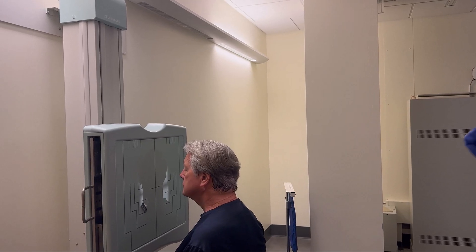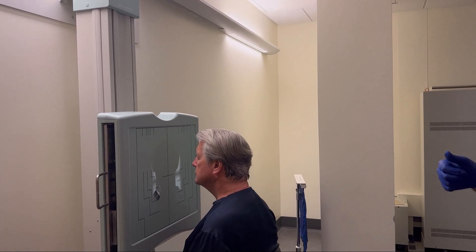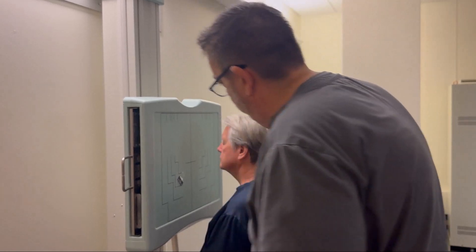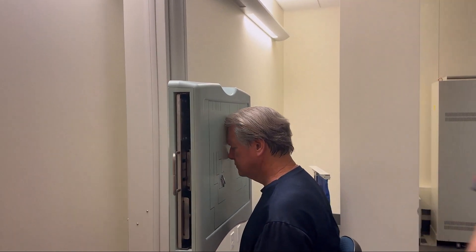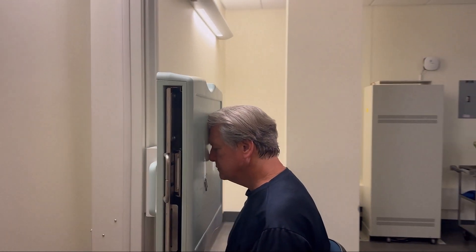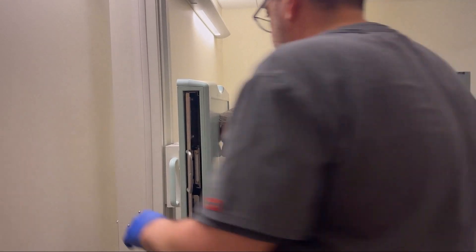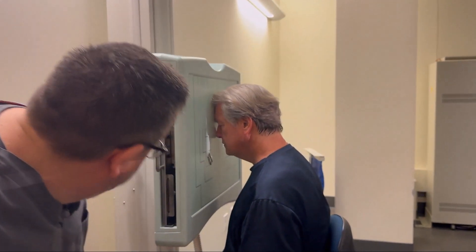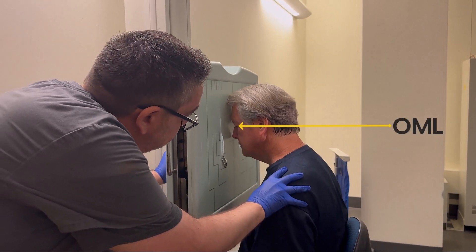However, we may bring that in once we see the light field on the patient. So I'm going to have you put your forehead and nose against the board. The central ray, like I said, exits the acanthion. I'm going to lower this down just a little bit.